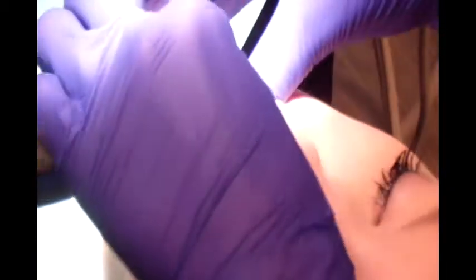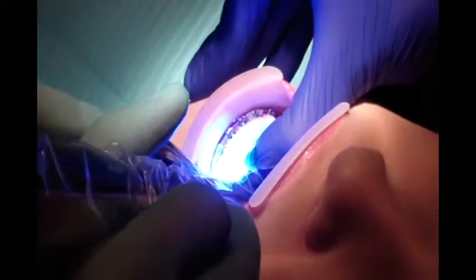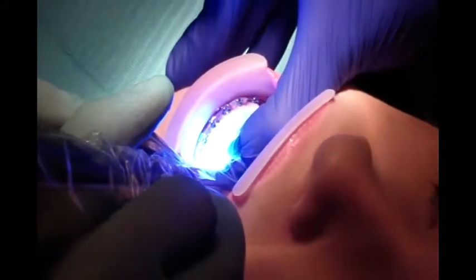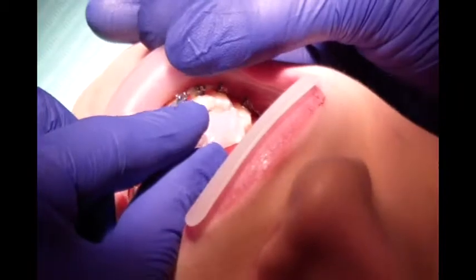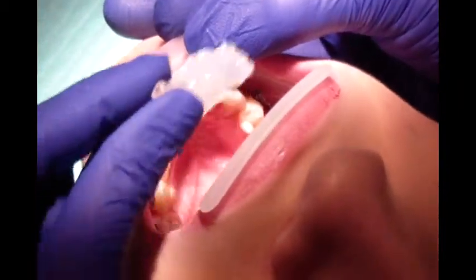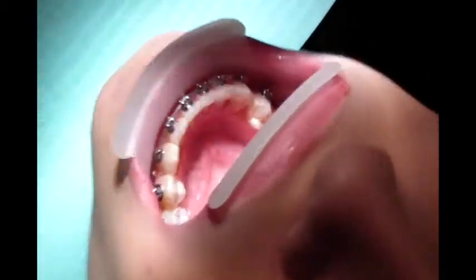Insert the index intra-orally into position, maintaining a firm pressure against the two surfaces. Light cure for 40 seconds. After curing, remove the index and continue curing for another 30 seconds.